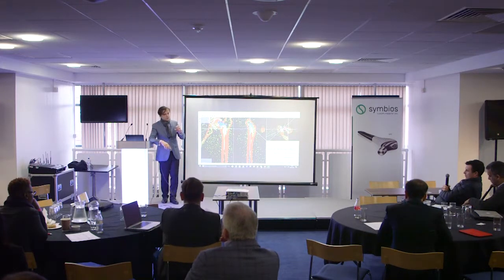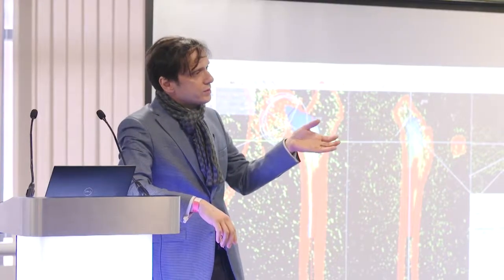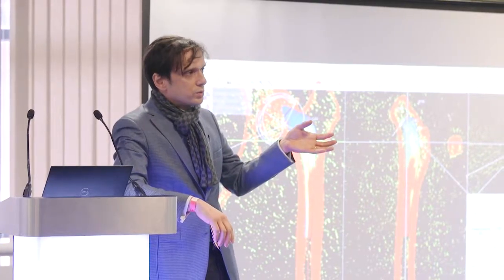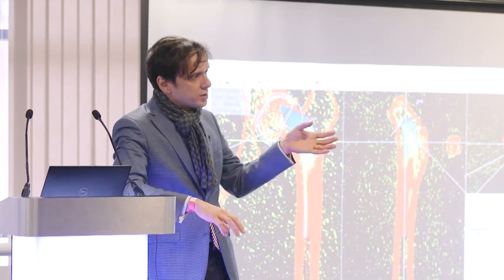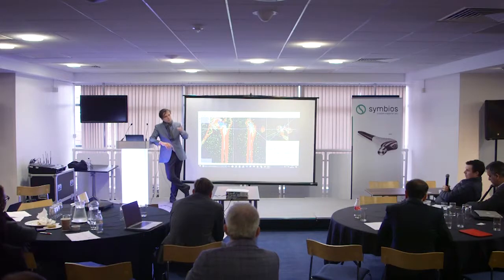But I would say in a quite standard valgus femur, I would really ask for a zero alteration, at least no increase. I would be really interested to see this case. When we start speaking about outliers, we really need to go into the details and see in the 3D planning what's going on.